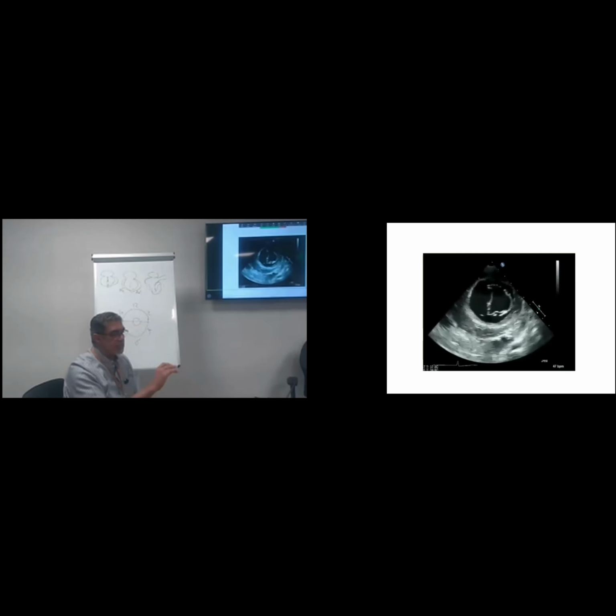It's arrhythmia. Don't be confused. Actually, pacing is usually regular. This is not regular. This is irregularity. But what about the RWMA, regional wall motion abnormality? RWMA. We have an RWMA.